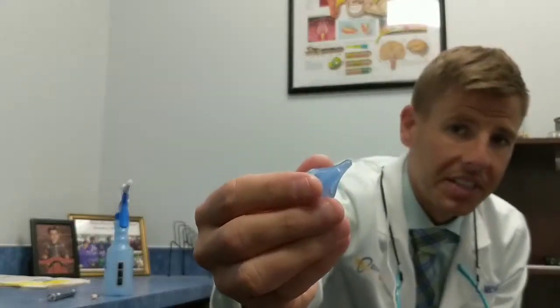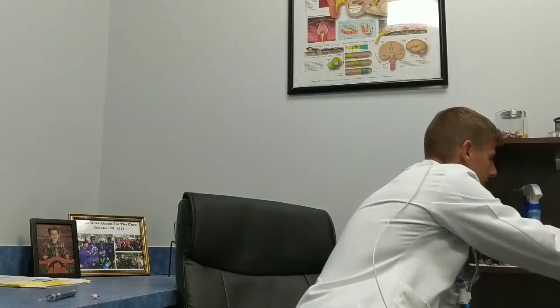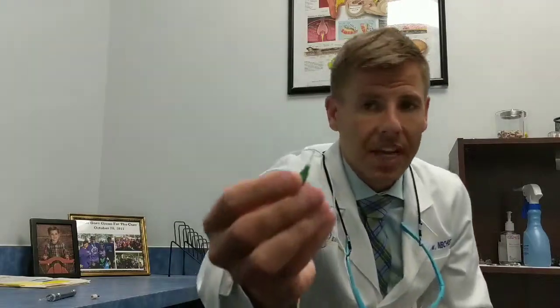The tips that go on these devices are very safe. The way they're designed, I can't push them too far into the ear. They come out in three streams so I can hit the wax in different areas, and because of all the venting, I won't have enough pressure to really worry about perforating an eardrum. If I need a little more pressure, you can find a catheter tip that's usually in your vacuum kits — but this increases pressure and the risk of perforation, so definitely be careful.